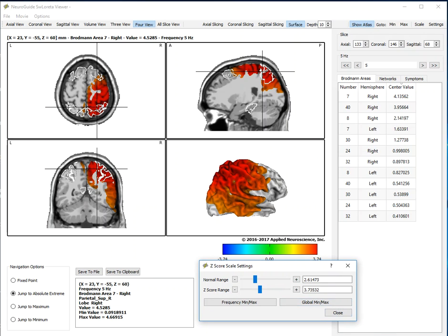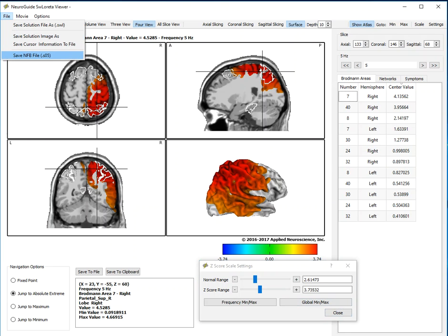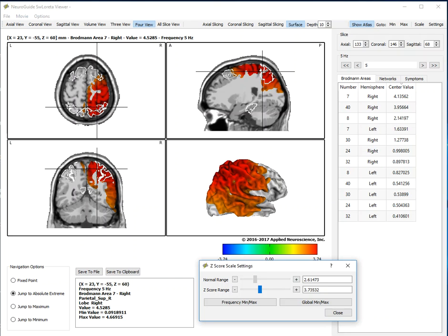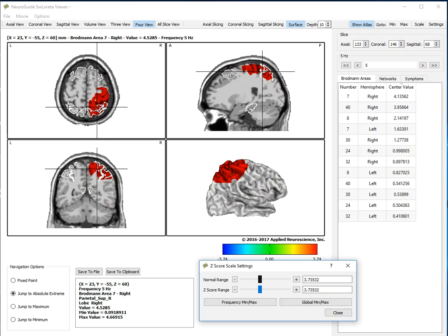And then when you click file, save the .SO5 file, you will have more Brodman areas since you've lowered the z-score. Or if you want fewer Brodman areas, you can raise the z-score. So that is the new feature.